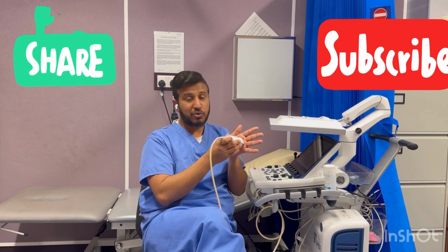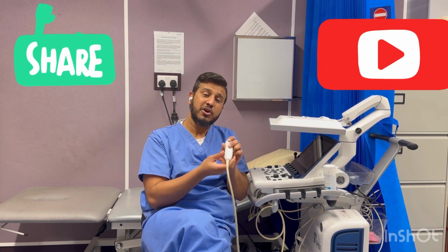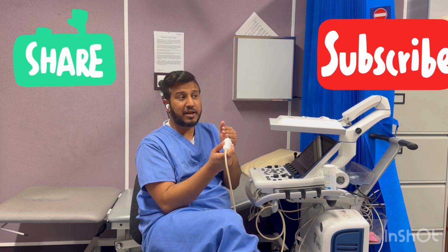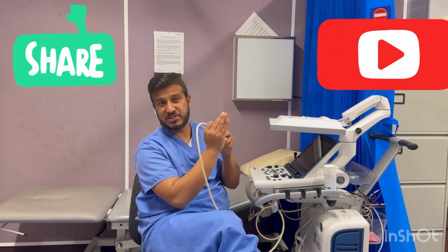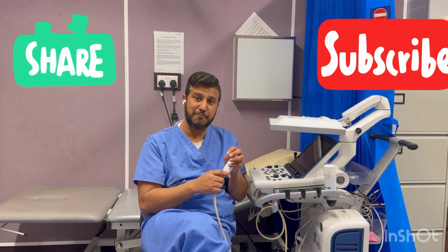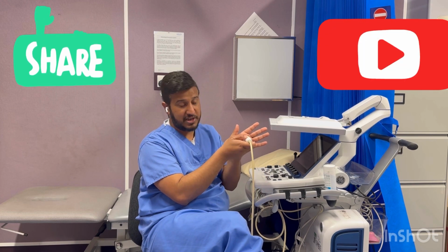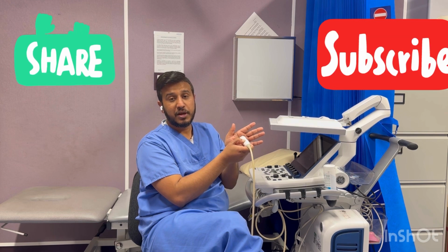So once you are going to get the aortic valve leaflets, you are not going to get a very good pulmonic valve. So you need to take your tail slightly more downwards to send your waves slightly upwards, slightly superior. You will take your tail down, so the waves will go slightly superiorly, and you will get the pulmonic valve better. So you will get the pulmonic valve, then you take your tail up to get the aortic valve.